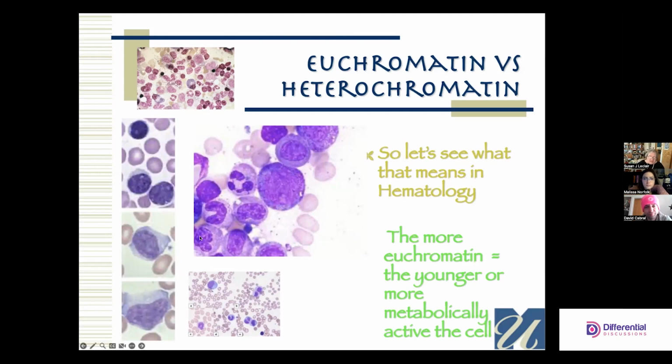And compare that then to this band. Not the same coloration, not the same texture. Yeah, you got a couple of dark places here that are lumpy. But remember, this is a teenager. You know, it's going to be lumpy. It's not going to be even.